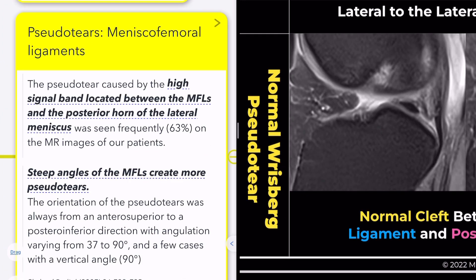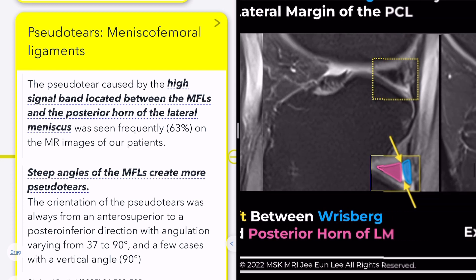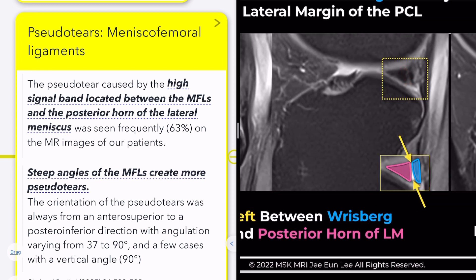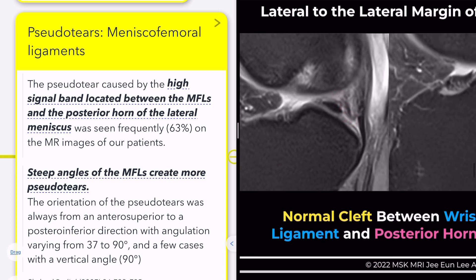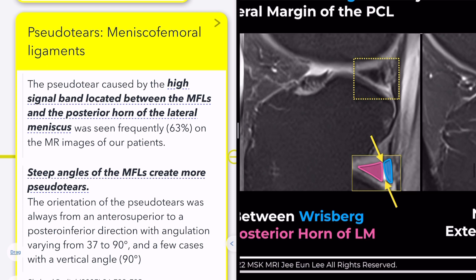However, it's important to note that the high signal band frequently seen between the meniscofemoral ligaments and the posterior horn of the lateral meniscus, termed Risberg pseudotear, can sometimes mimic the appearance of a Risberg rip tear. Pseudotears typically have an anterosuperior to posterior inferior orientation, which may lead to confusion, especially if they appear to have a vertical angle of 90 degrees.